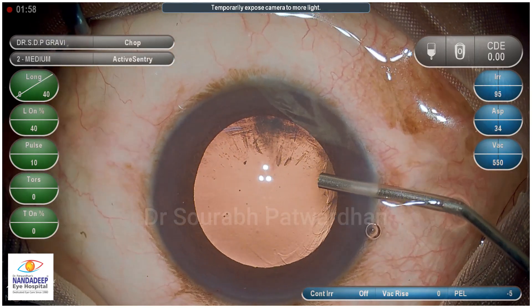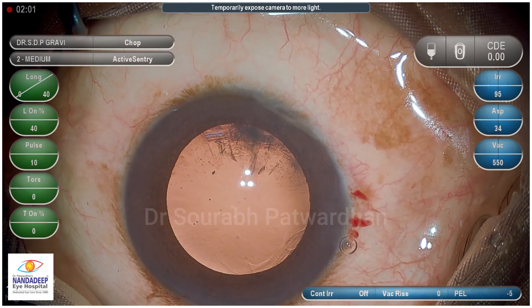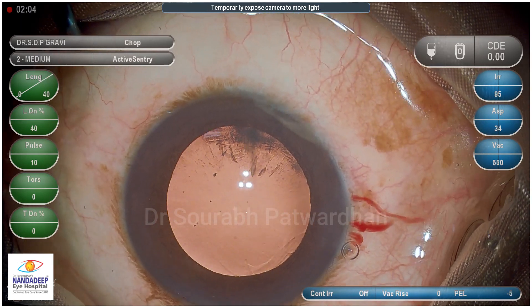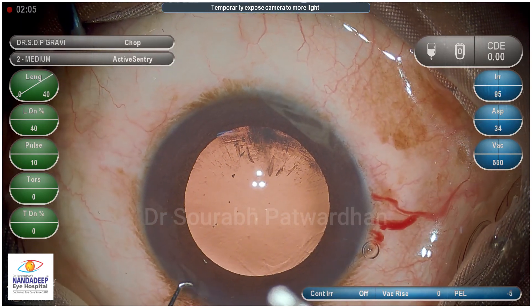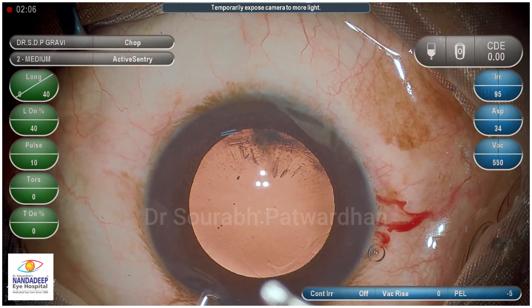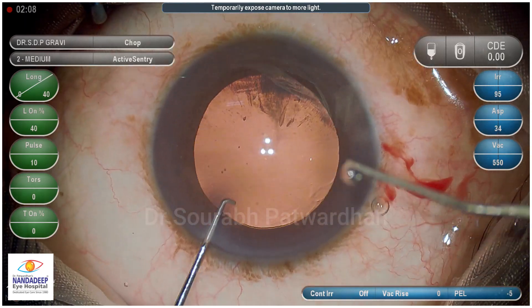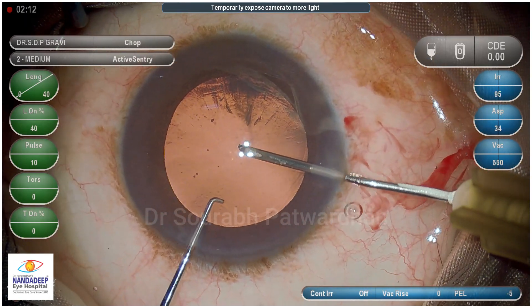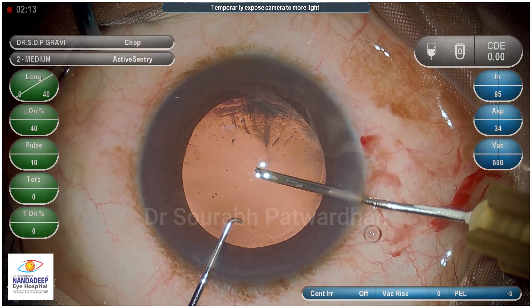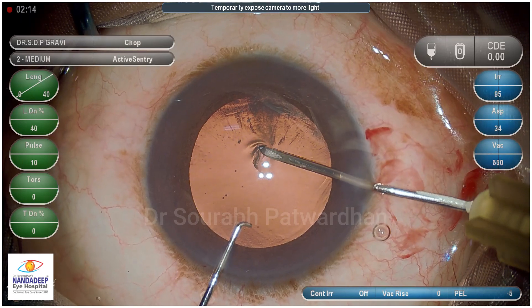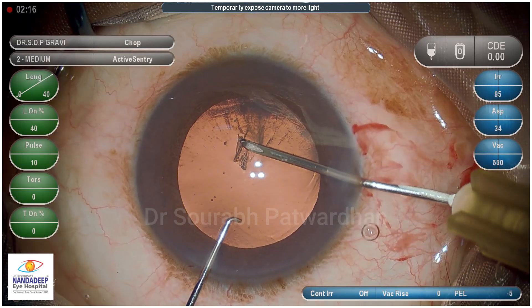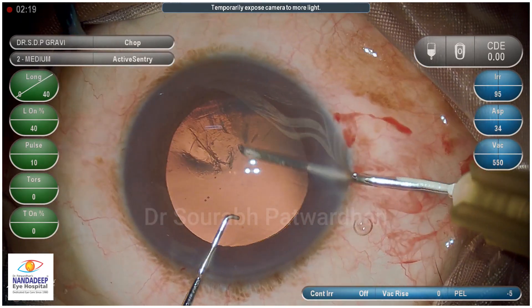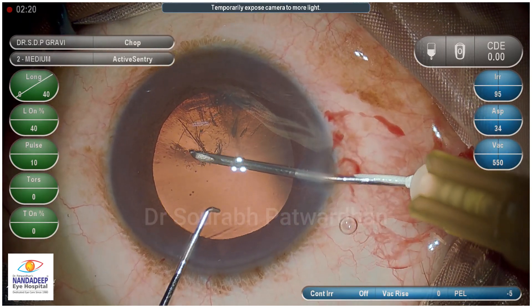That was 2% HPMC. Now I use the bent cystitome to do the capsulorhexis using the main incision. This bent cystitome avoids leakage of the viscoelastic from the main wound. But there you can see what happened.